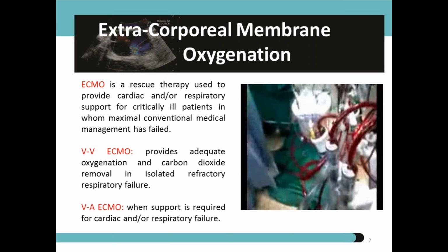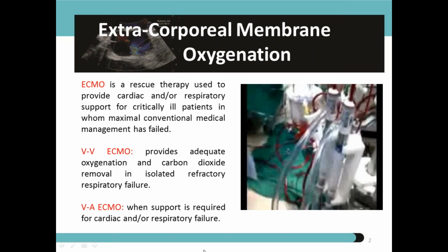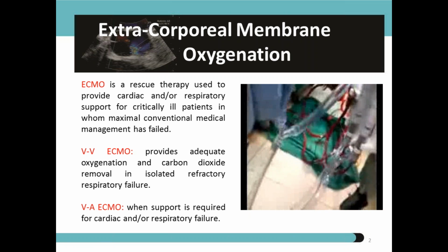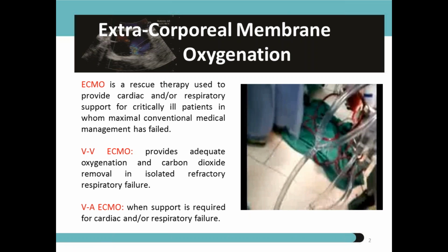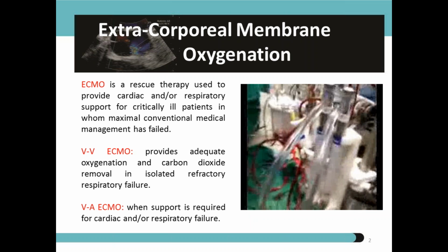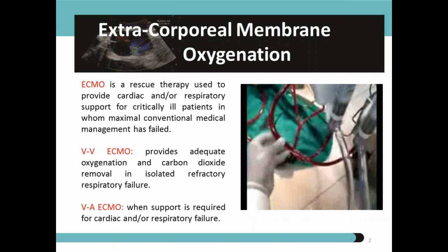And when we come off the patient after the switch repair, we come off on the ECMO bypass, not the CPB bypass. So once you are doing something like that, you are saving time. The surgeons are putting in the cannulas like they do for a CPB, for a corrective surgery, under all asepsis. So infections, bleeding, the time to set up an ECMO machine, the running here and there, all that commotion that happens and makes an ECMO fail because you waste time.